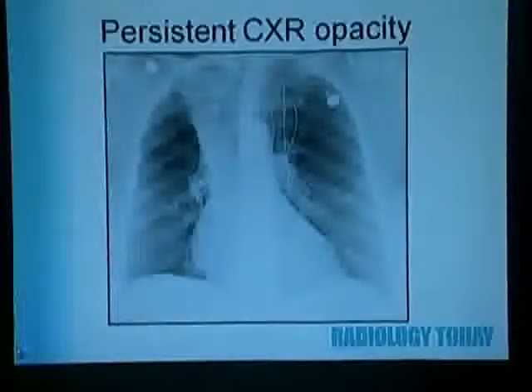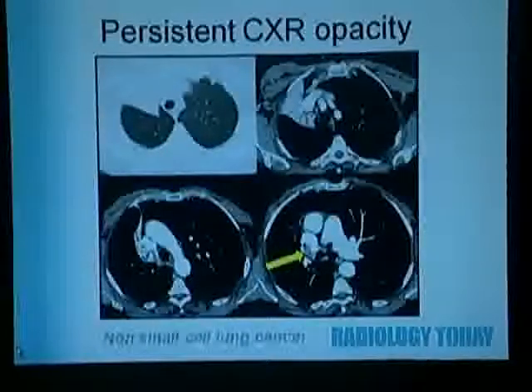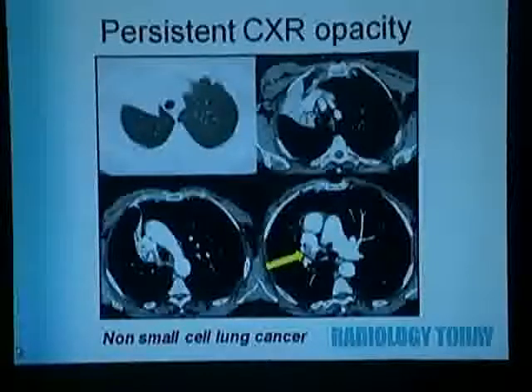And in this case, this person had a right upper lobe collapse. Now, sometimes we'll see collapse atelectasis, which will just resolve. But in this case, it didn't resolve. So always the concern in the back of our minds is, could there be something centrally obstructing a bronchus or causing mass effect? A contrast-enhanced CT, again, contrast-enhanced because we're looking for something central. We want to delineate this from the vessels, was obtained. Shows that the person has that right upper lobe collapse, as well as, very importantly, a central mass, which turned out to be a non-small cell lung cancer, causing that collapse.